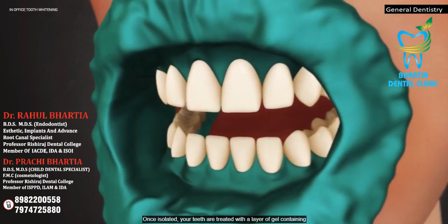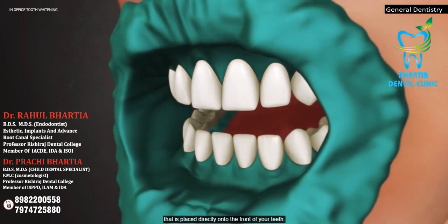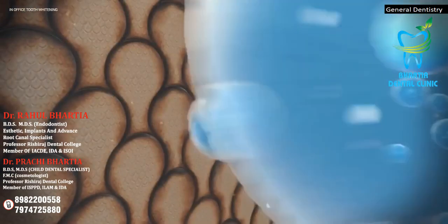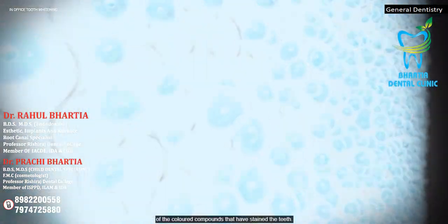Once isolated, your teeth are treated with a layer of gel containing hydrogen peroxide, which is activated with a blue light source that is placed directly onto the front of your teeth. The reaction of the light on the gel causes the breakdown of the colored compounds that have stained the teeth.